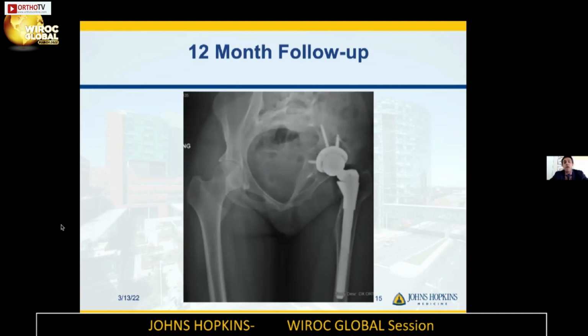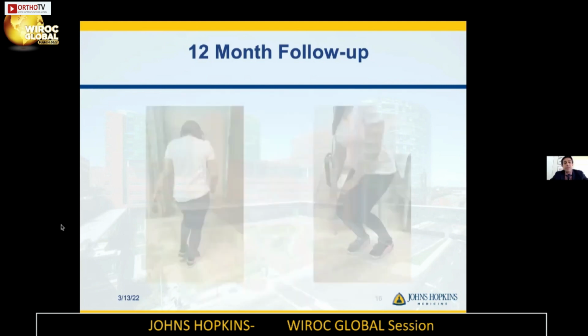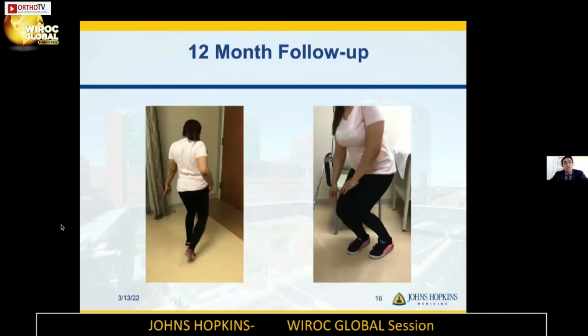This is her image at 12 months of follow-up, again showing that shelf osteotomy has nicely contained this prosthesis, and she's had no dislocations, no infections, no instability. And let me show you some videos of her function. So this is her ambulating.